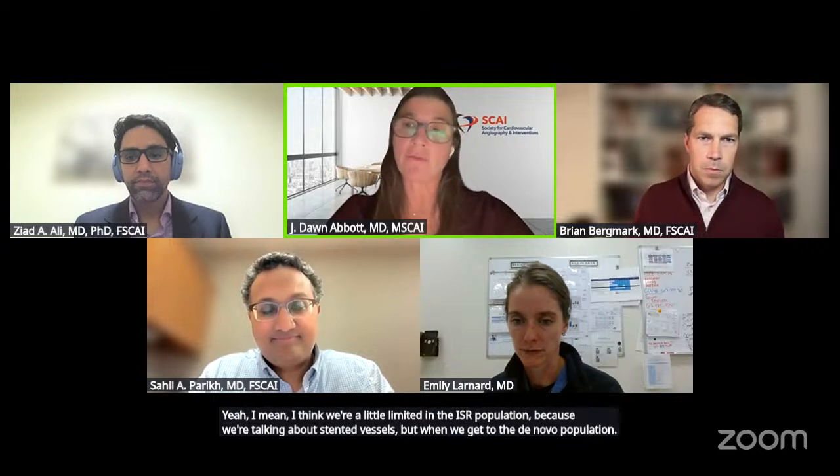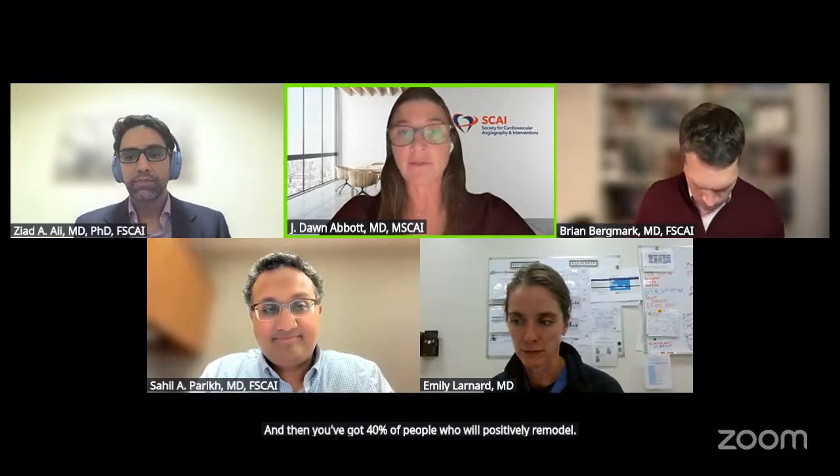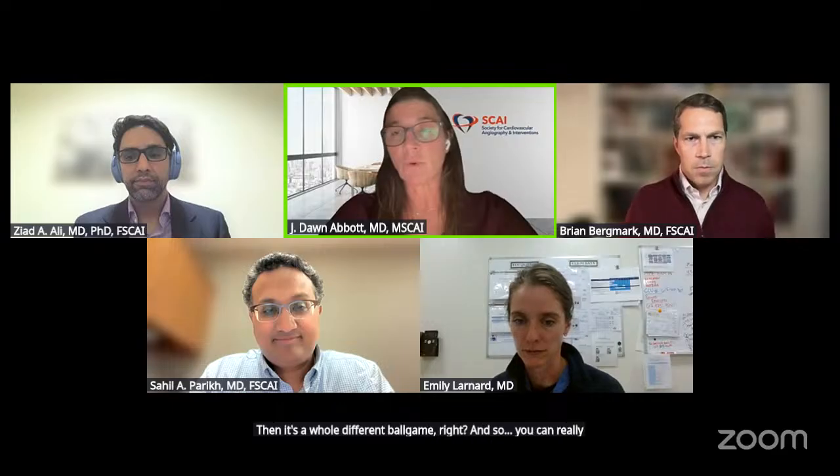Yeah, I think we're a little limited in the ISR population because we're talking about stented vessels, but when we get to the de novo population, and then you've got 40% of people who will positively remodel, then it's a whole different ball game, right? And so you can really wait and limit it.